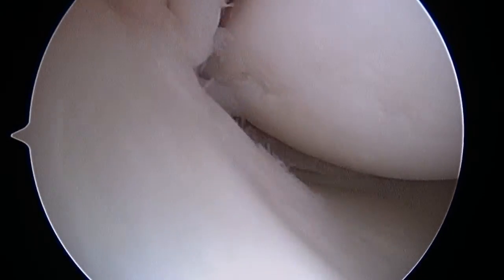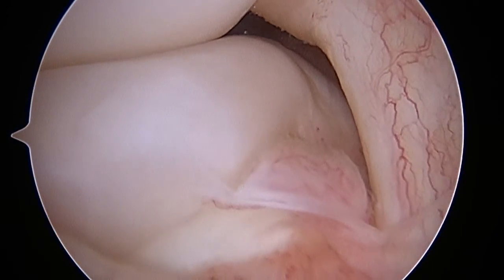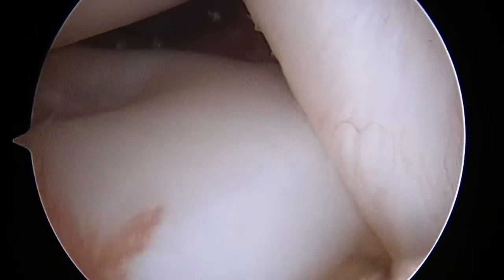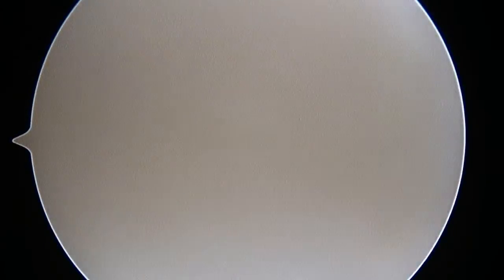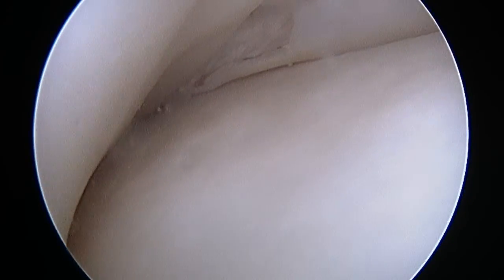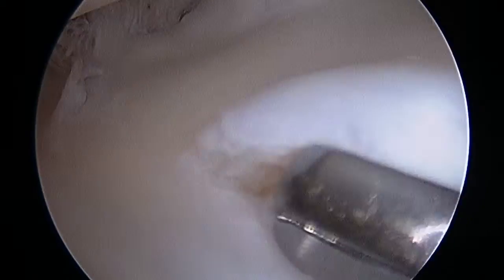Here we are at surgery. You can see the medial meniscus which looks fairly normal. As we look laterally there's a large piece of tissue obstructing our view — as I probe that, it's actually the discoid meniscus. Continuing to probe further, in the back corner we can see a tear. This is due to the fact that this football player has been running around on the discoid meniscus — 100% of his body weight going through that meniscus with every step rather than the normal 50%, so ultimately that tissue can't hold up and it tears.